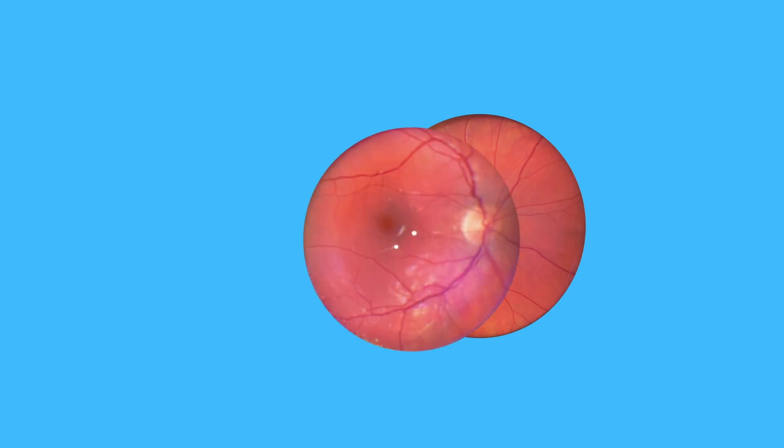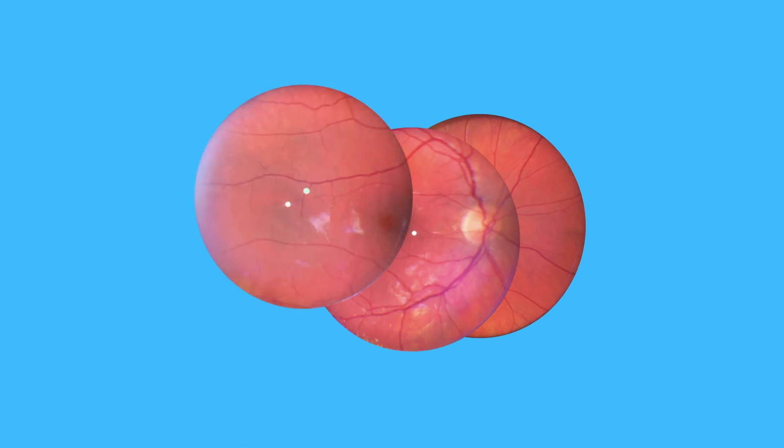Now I will show you the exact borders of each fundus region to image. Start with an image centered at the disc, then acquire an image centered on the macula. Now acquire an image from temporal of the macula. Make sure that the center of the macula is still visible on the border of your image. Now we have acquired images from the 3 horizontal regions of interest.